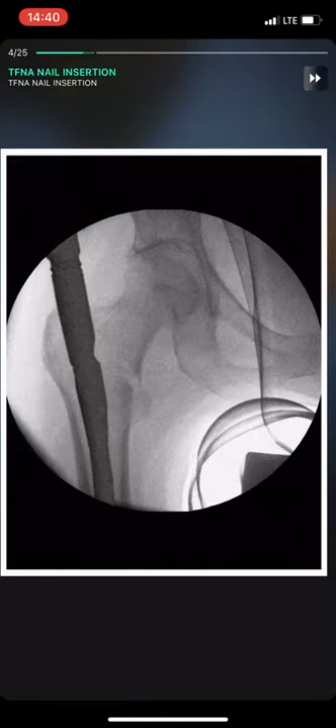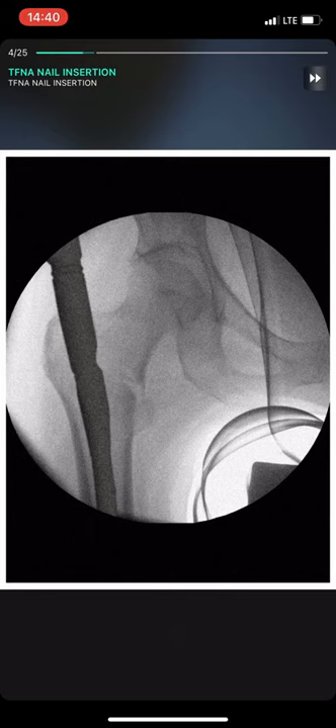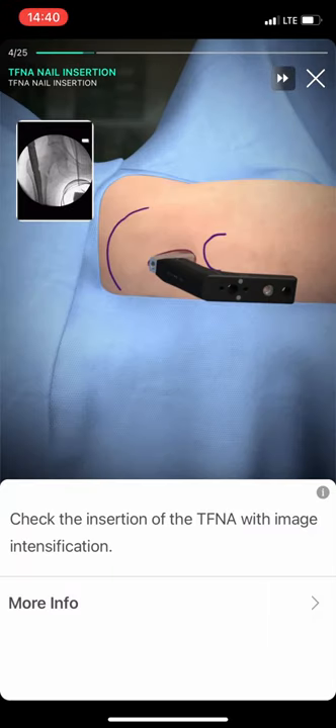Check the femoral insertion of PFN with image intensification.